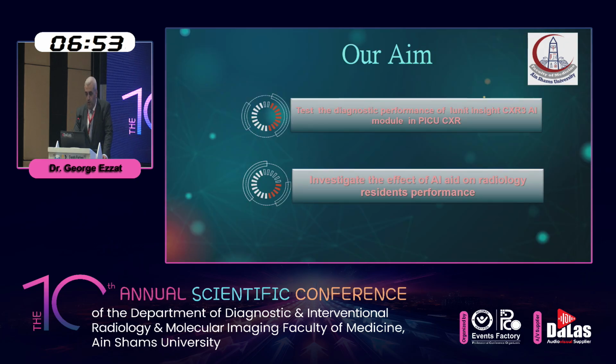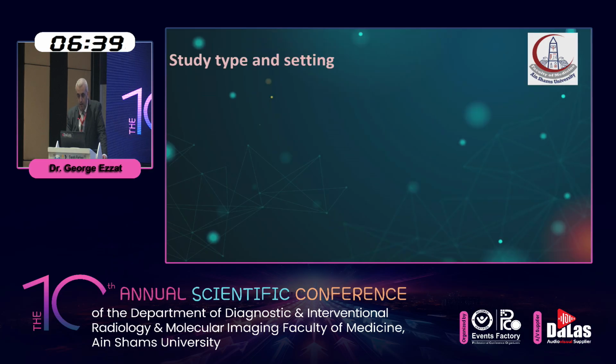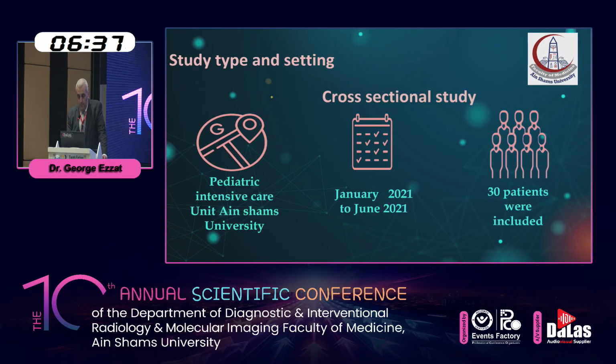The aim of the study was to test the diagnostic performance of Lunit Insight Chest X-ray in PICU chest X-rays and investigate the effect of AI specifically on residents' performance in chest X-ray interpretation. The study was done in pediatric ICU patients at Ain Shams University, and 30 patients were included.